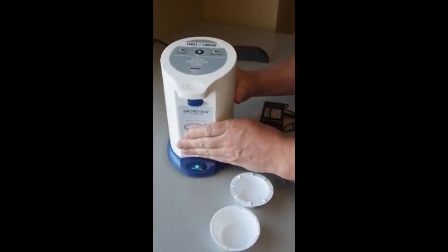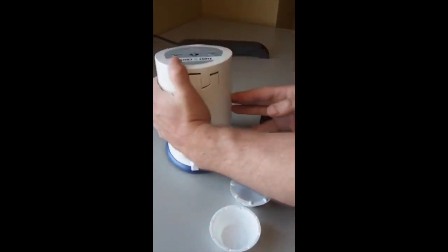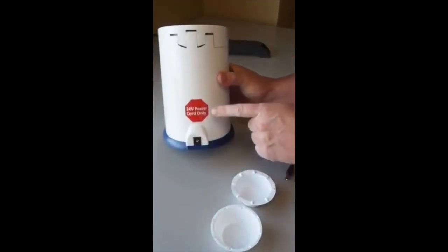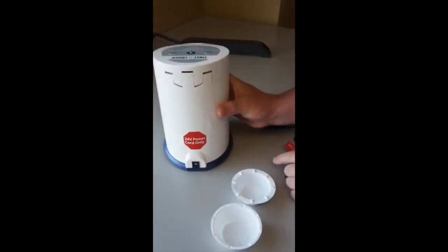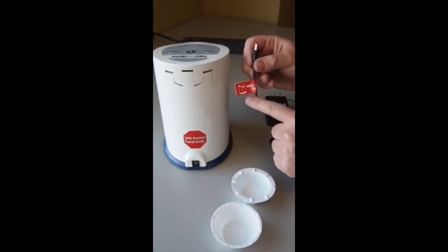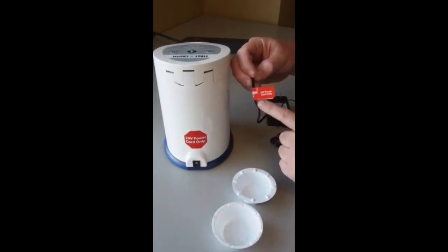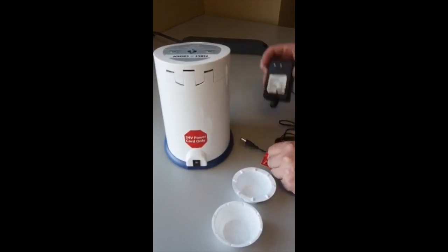To use the rechargeable battery, you will plug it in each evening. It requires only one charge per day, as you should get over 300 crushes on a fully charged battery. To ensure you're using the correct power cord, check that the red sticker on the power cord matches the red sticker on the back of the pill crusher.